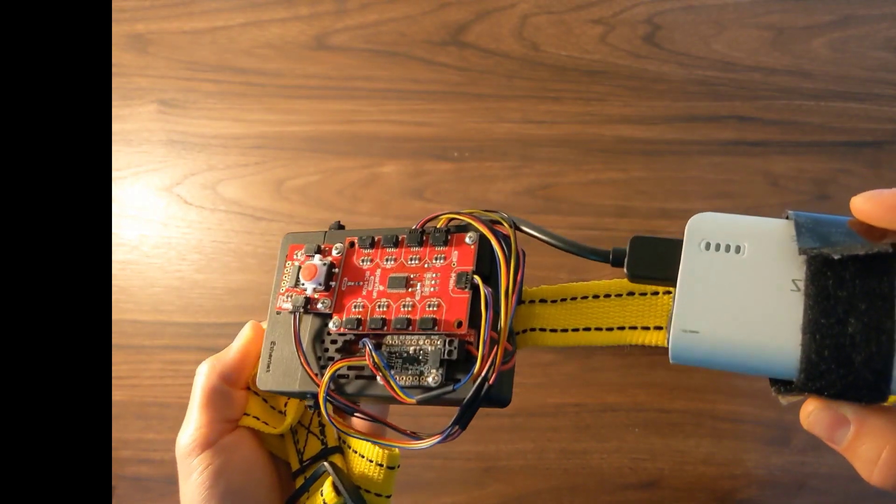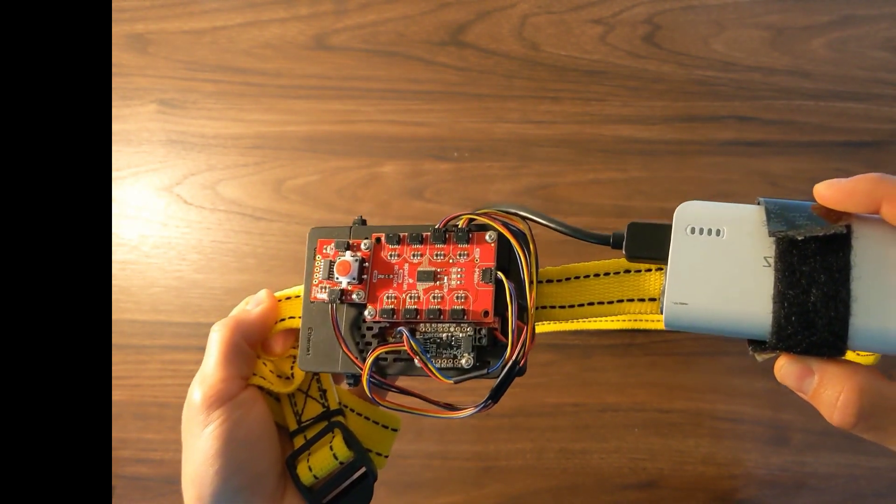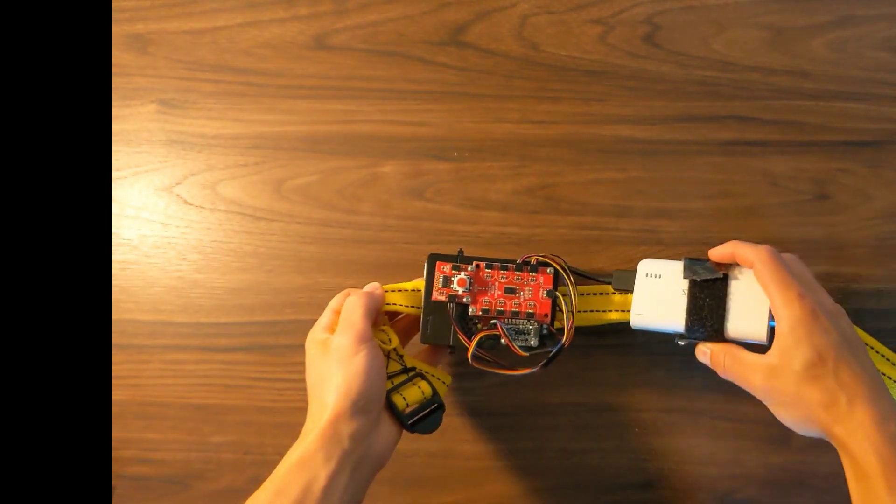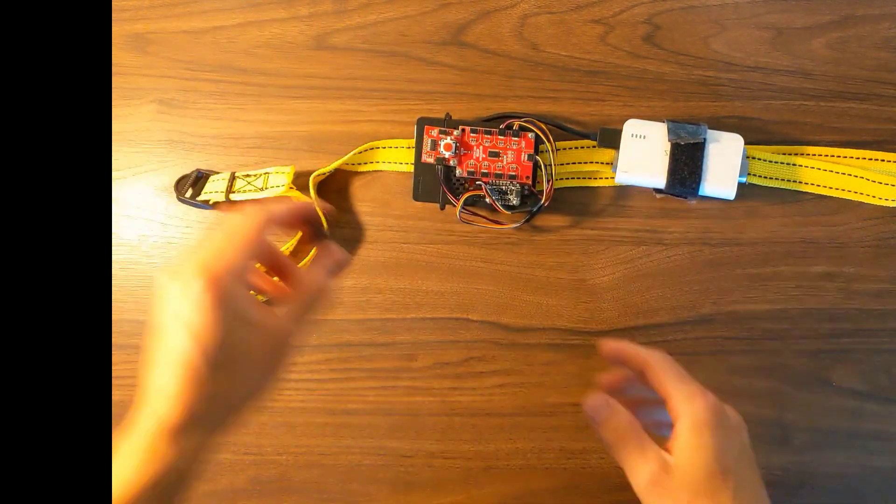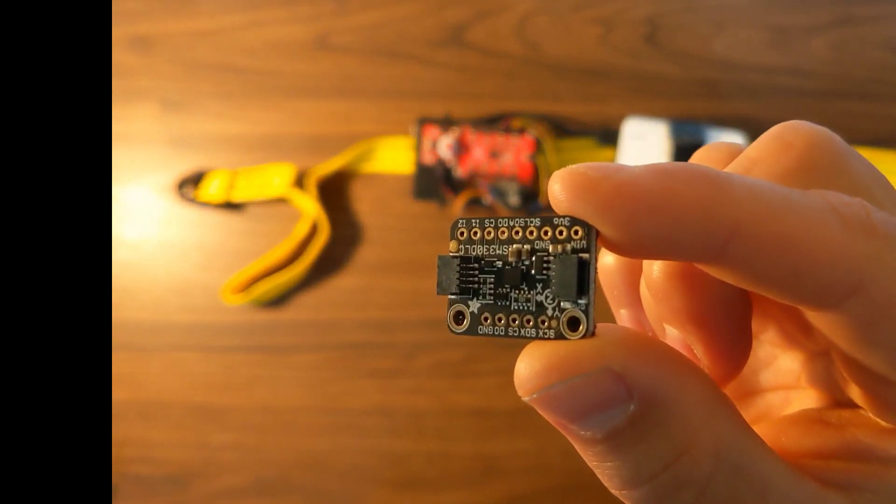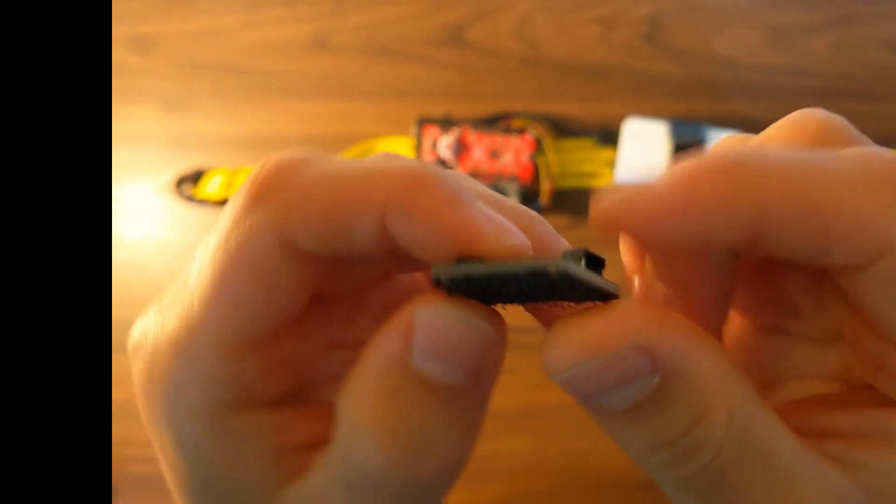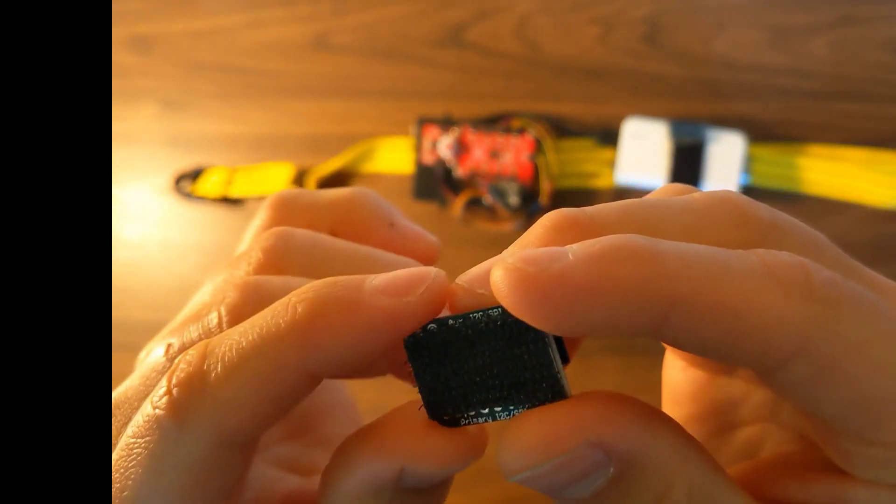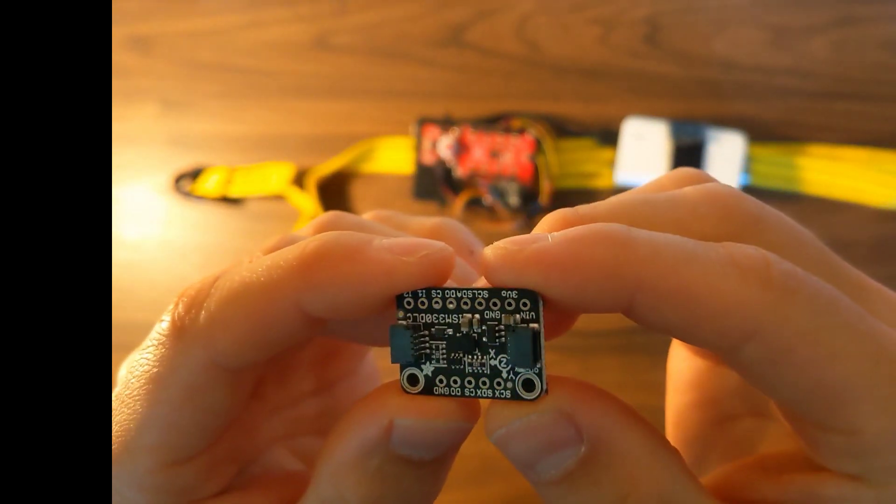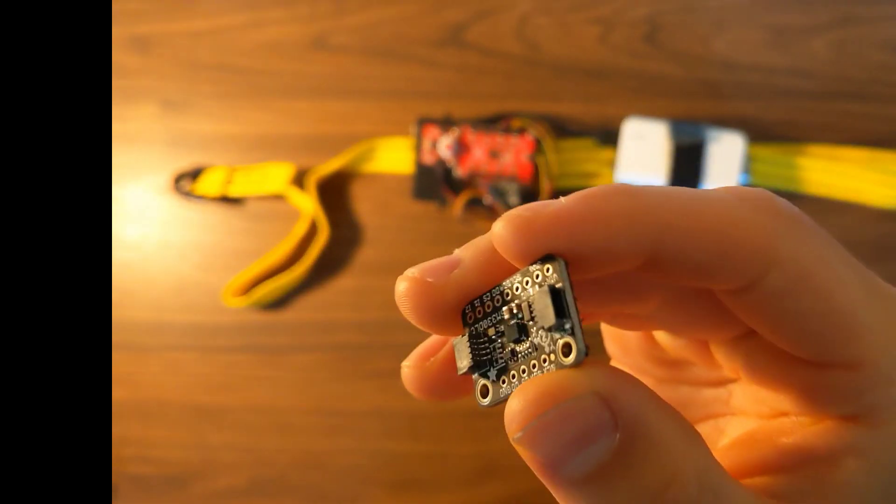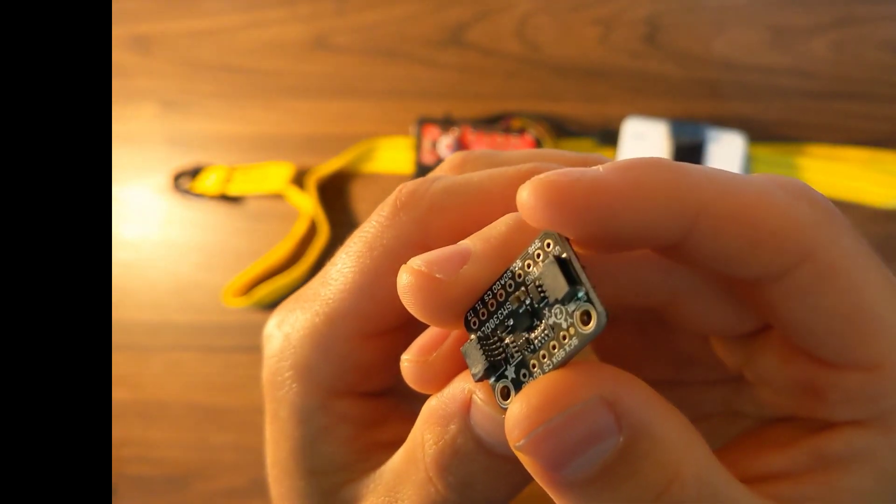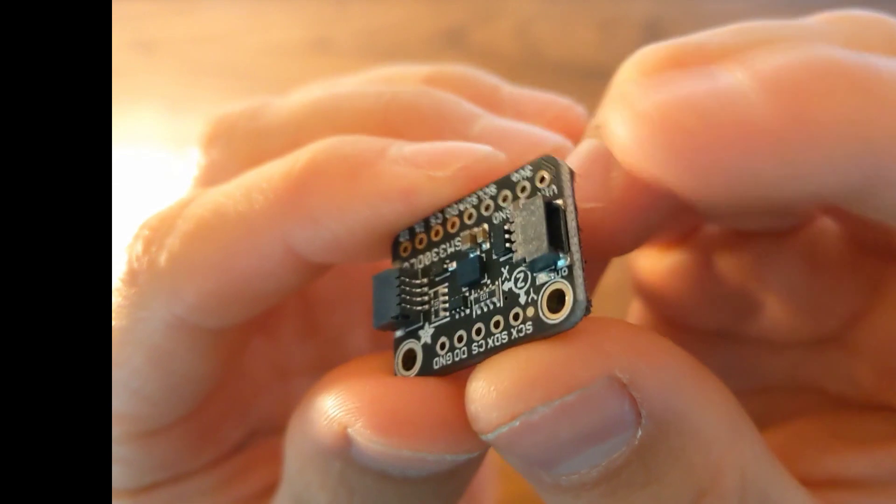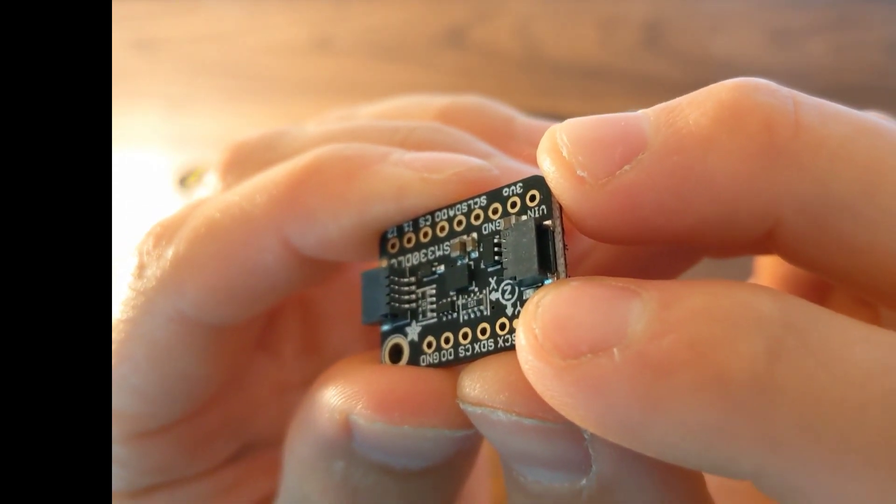The last step before we can put this on and start moving is to add the IMUs to the limbs. For this simple example, we'll use two IMUs. You'll notice that I've already attached some Velcro. So you'll want to cut that and stick it to the back to adhere to the straps.